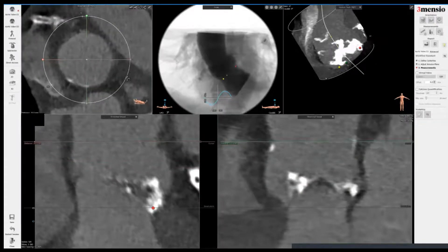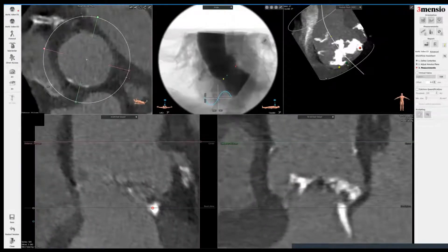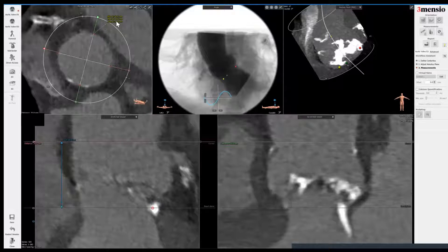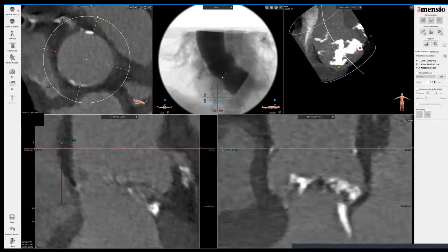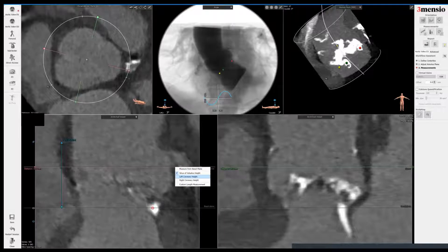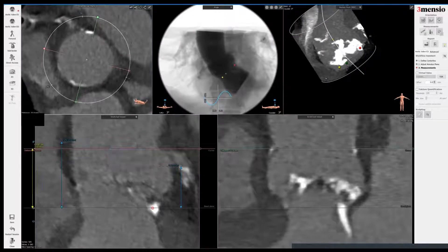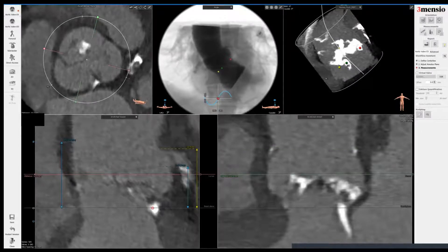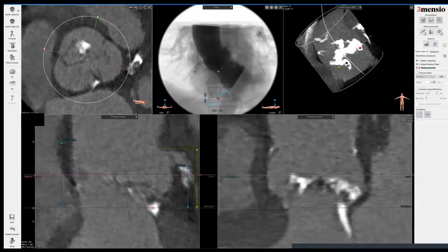I go up to the sinus tubular junction, just like my previous workup video. Then I right-click on the bottom left to get the sinus height. I then measure the sinus tubular junction — I use the ruler with times two so I can get the long and short axis, and I label it as sinus tubular junction. Now I look at the left main. You can see the left main ostium is visible here pretty well. I right-click on the bottom left panel — this is my left coronary height label. I also look at the left sinus because that has relevance in terms of coronary obstruction risk, especially in a small aortic root.